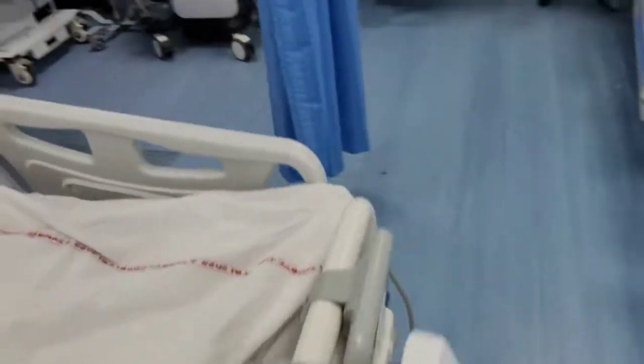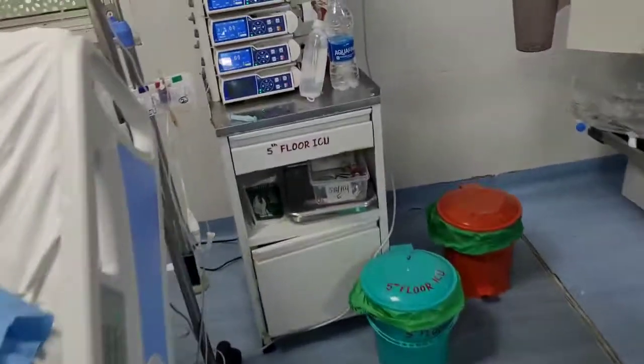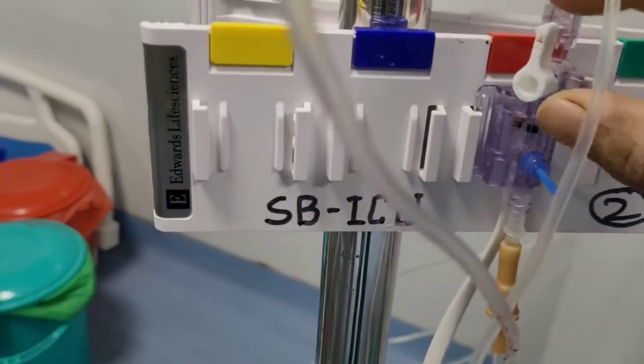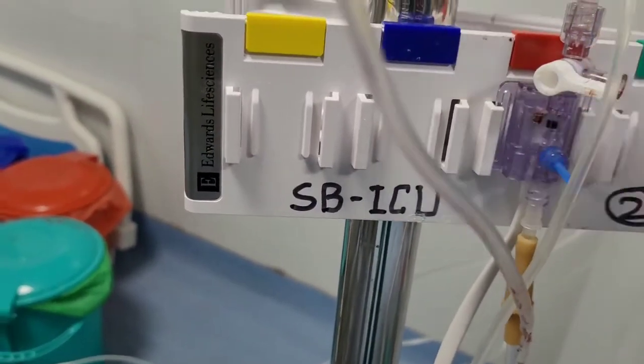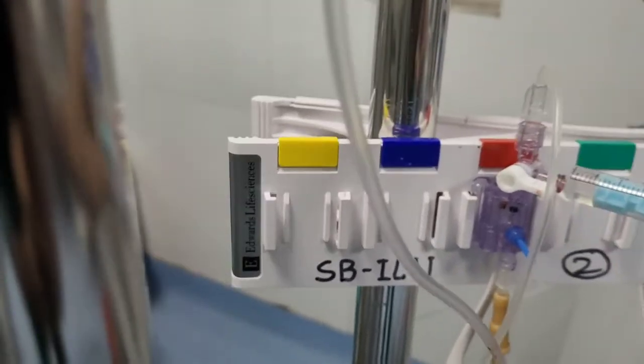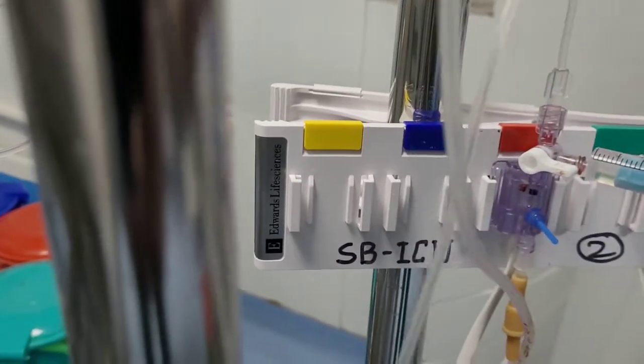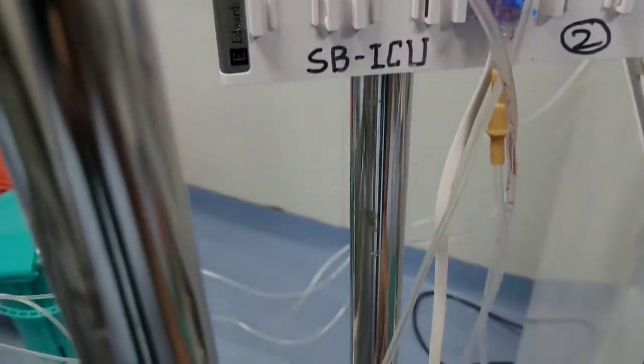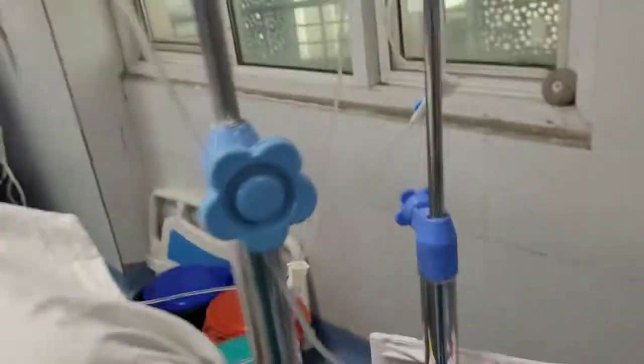Go to home, and again we turn this to the left side and put the syringe in. The whole channel is now connected to this probe and will show the arterial pressure.